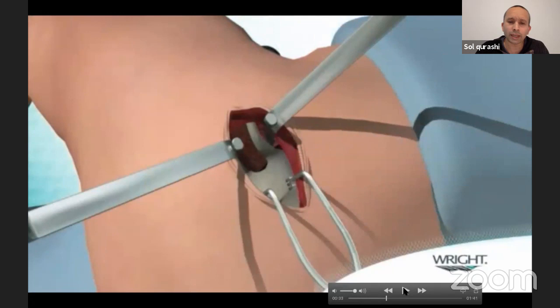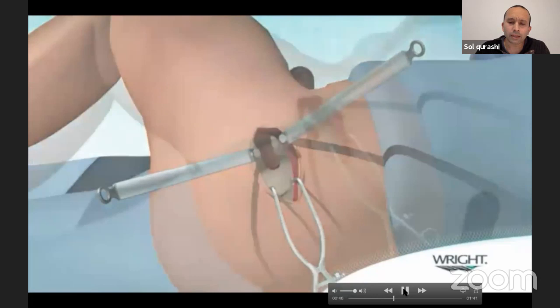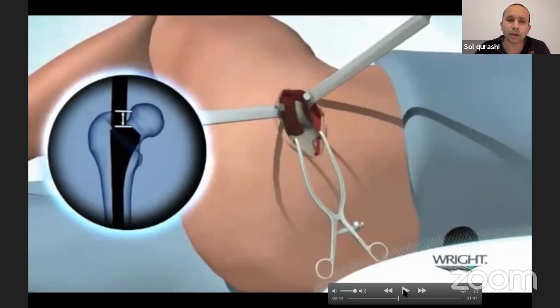And you put your broach, you do a bit of curetting, make sure you don't have any ridges, et cetera. You can make this hole a bit bigger if you need to. Then you've got the broach. Now, broach has an inline broach handle. You can use one that comes out the side of the wall. You might have to make a slightly bigger box cut. And you're looking straight down the canal. So you broach it, tuck, tuck, tuck, tuck, tuck, tuck, until you get to the size you want.